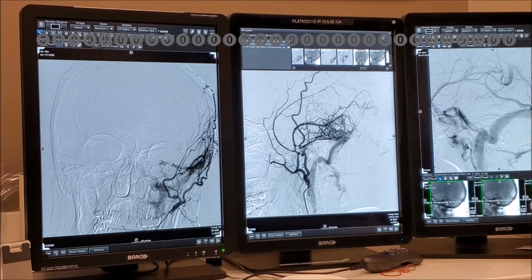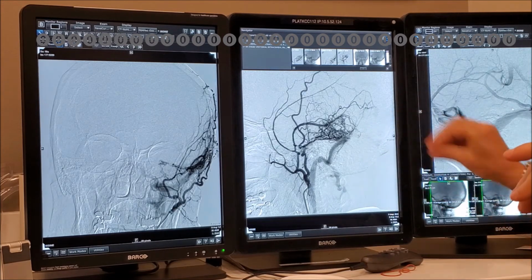In which case you potentially convert it to a high grade, because you can get arterial outflow via the right labbe. But I think actually when you come in transvenous, you can explore that, and you probably will find a channel. So you'll go beyond and then you close it.